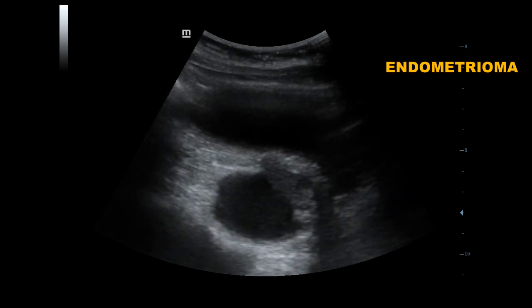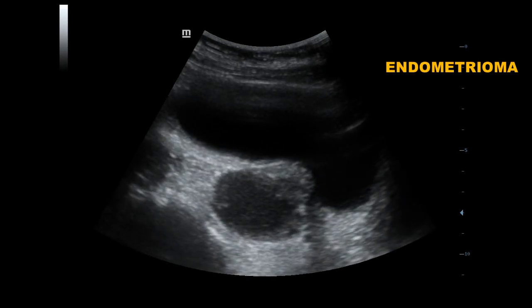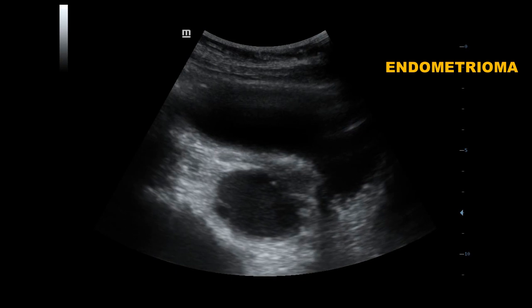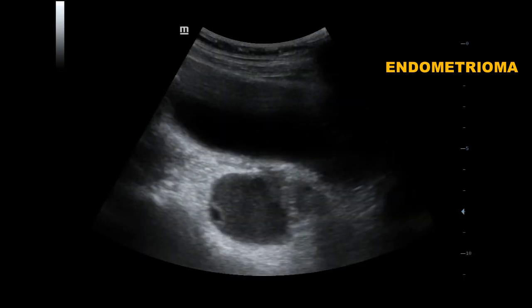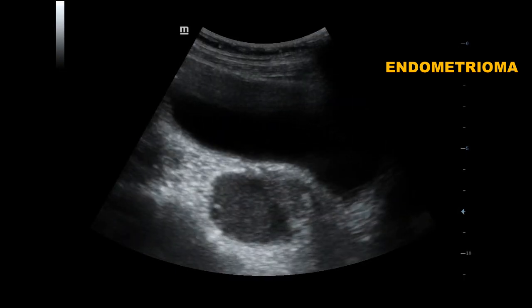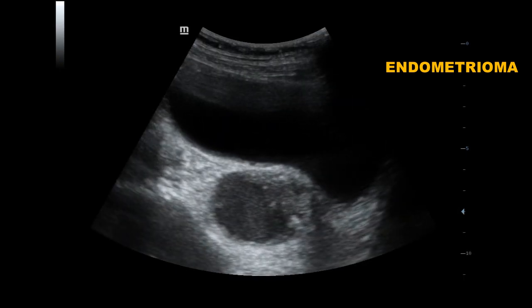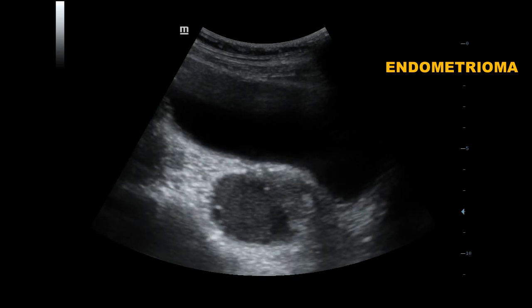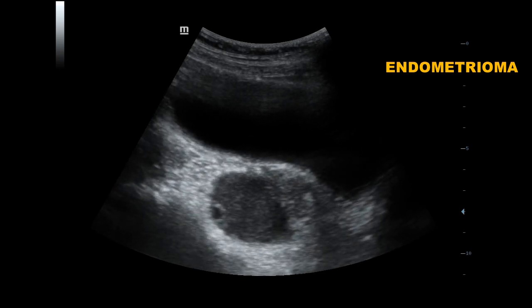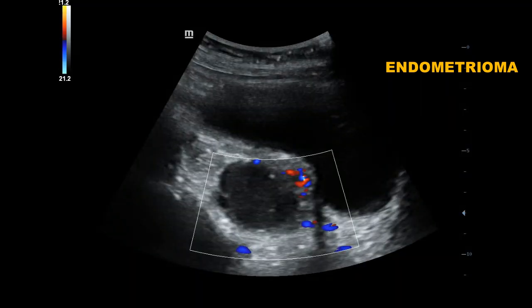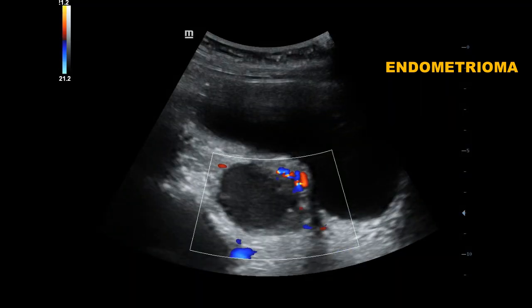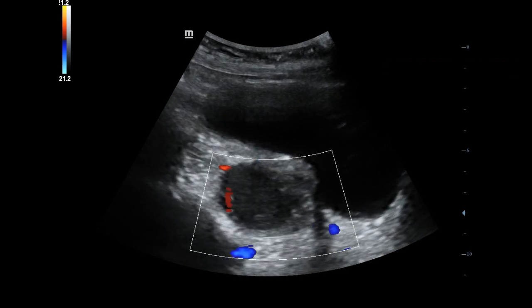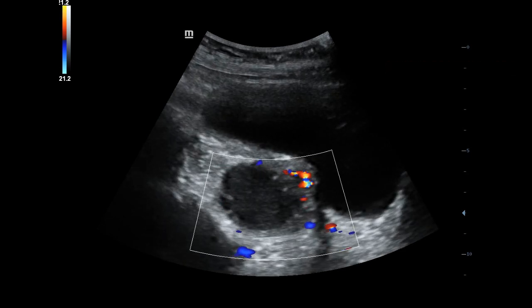This is an endometrioma, or chocolate cyst — a well-defined unilocular cyst containing diffuse, homogeneous, low-level internal echoes representing old blood in the cyst cavity. A few hyperechoic foci present in the cyst wall may be due to cholesterol deposit.